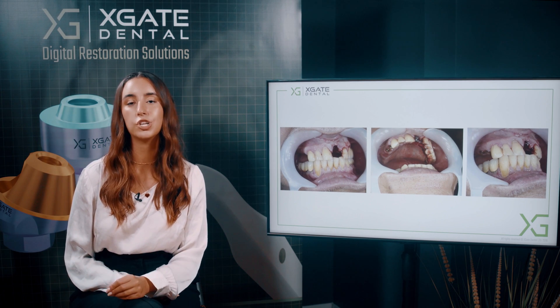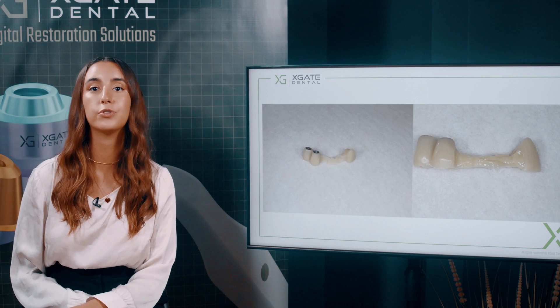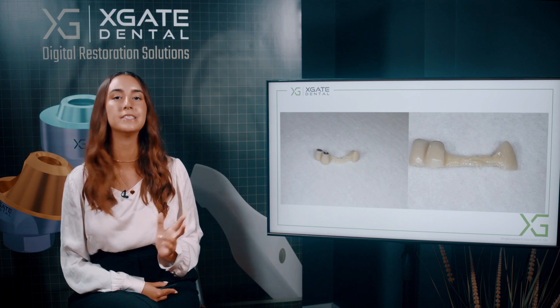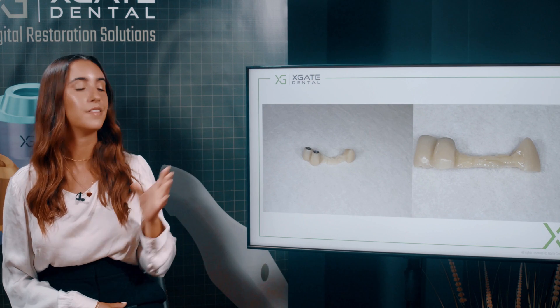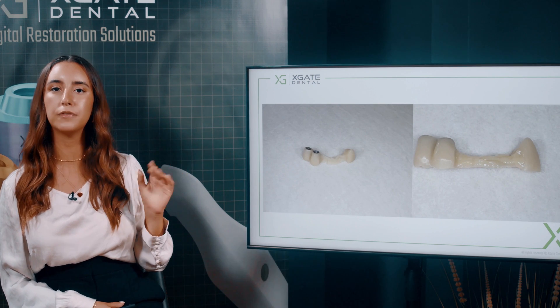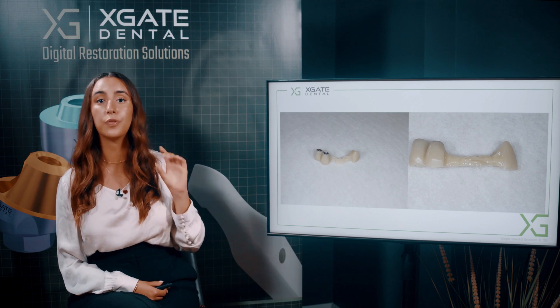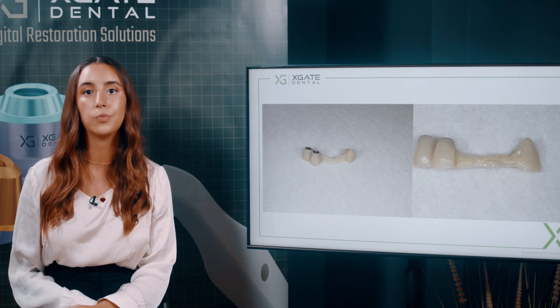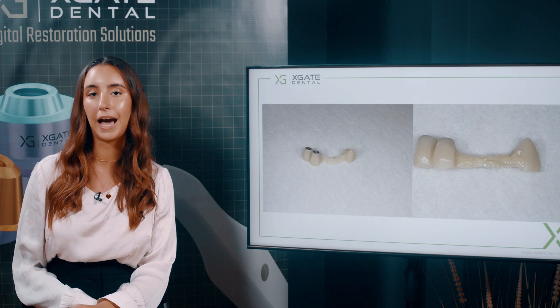You just need the restoration to not interfere with the gingiva. Here you can see the space — we took off the bridge and he is missing one tooth. Now let's look at how the screw-retained Maryland bridge looks. You can see there are two abutments and two sleeves for those two crowns. With multi-units, you have this span where we added a little bit of composite to fit exactly with the contour of the teeth, and we have this missing tooth we want to restore temporarily.